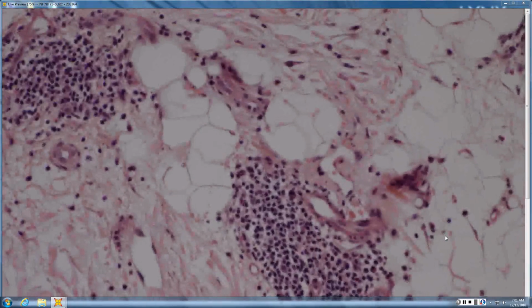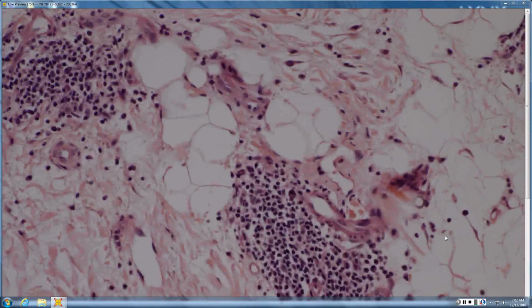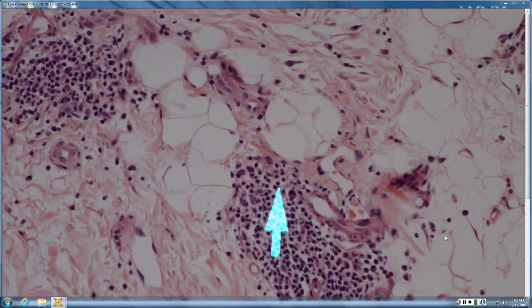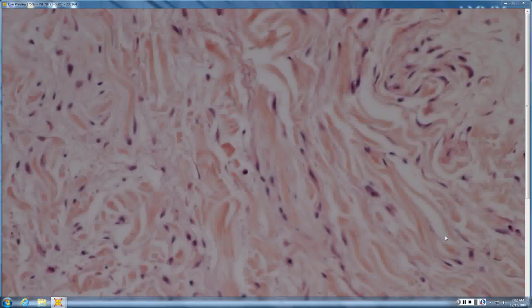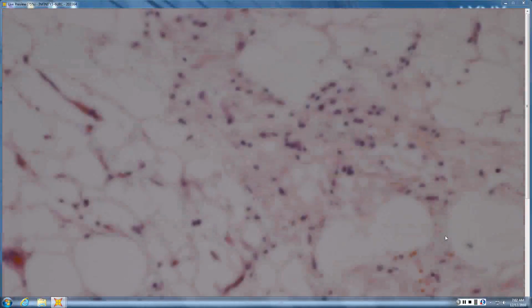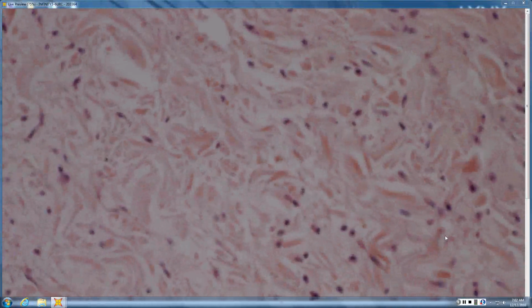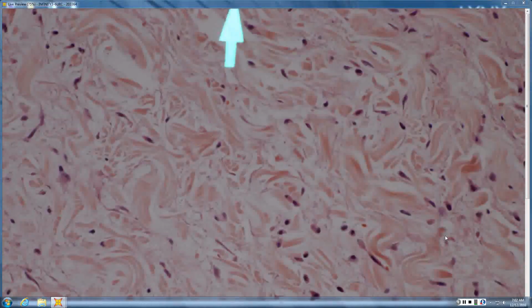dermatitis. What else is in here, which is a nice plasma cells. So it's nice when they're there. You also have to remember that sometimes it's site specific, so it doesn't mean as much. And then what's probably in here if we were to stain it up? Mucin. Good. So there's probably increased mucin.